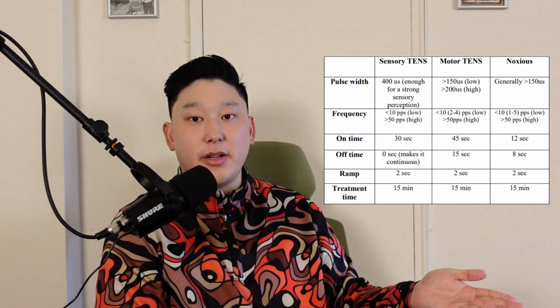And I want to remind you, regardless of the type of TENS that you use, they're all going to result in the same type of pain relief effect. Now, if you're curious about the different types of TENS, then I'll leave all the parameters right over here for you to look at.